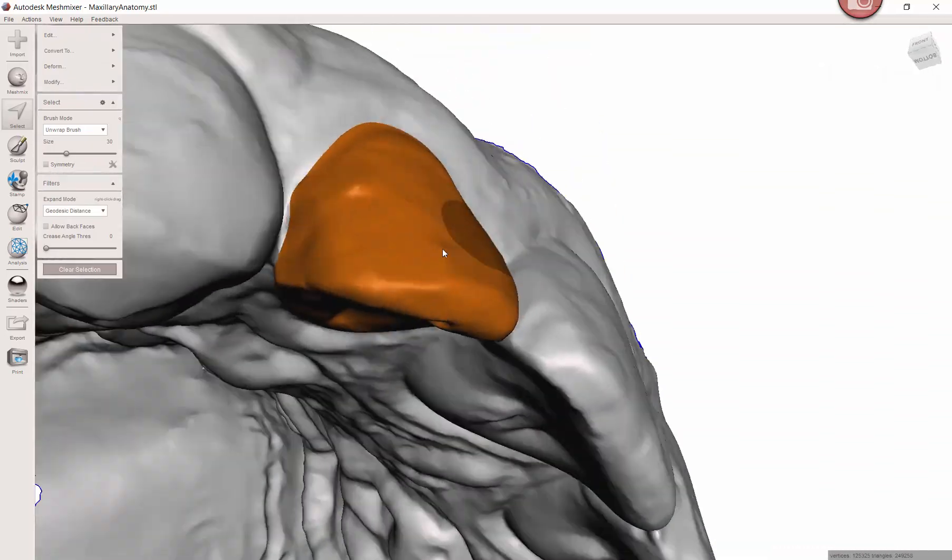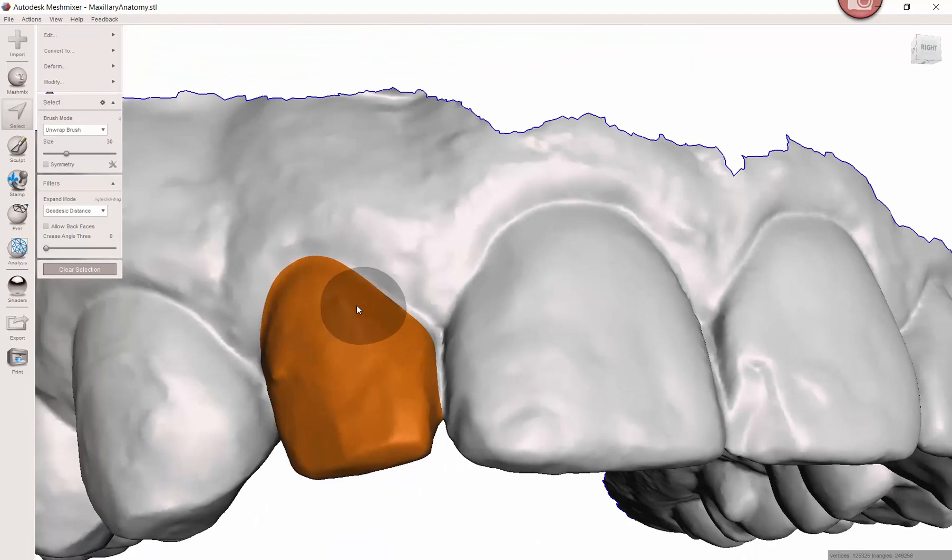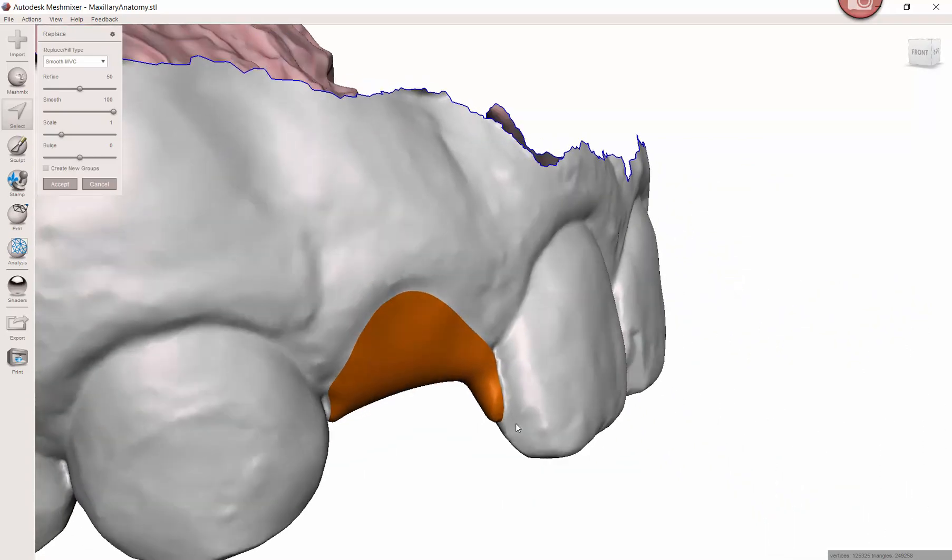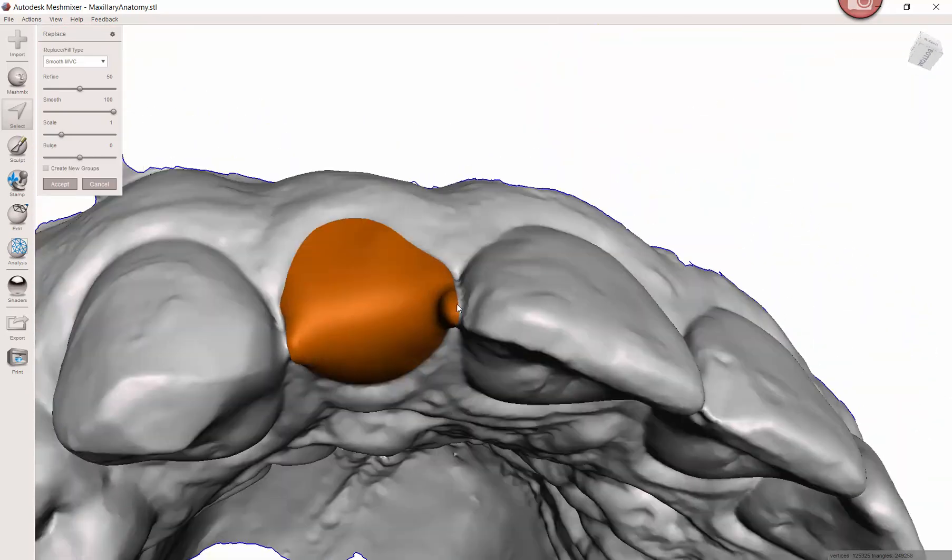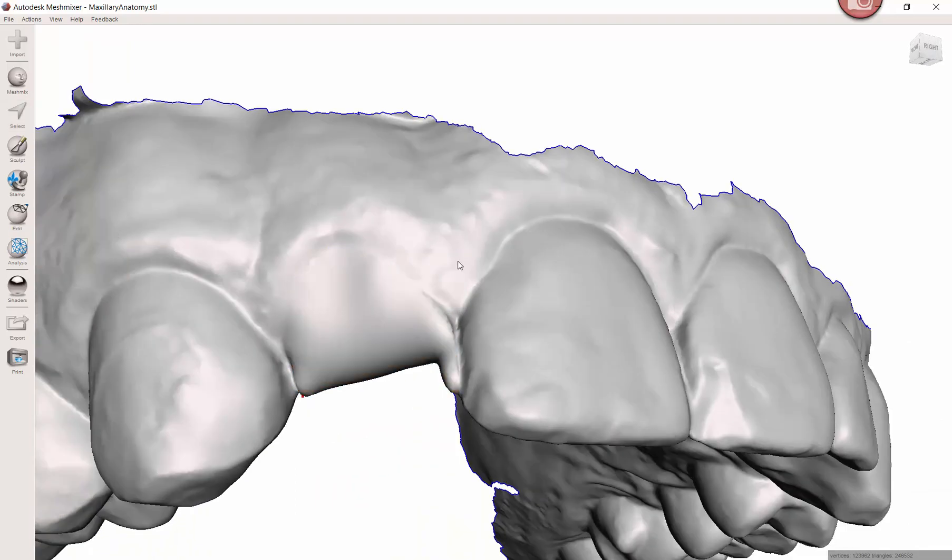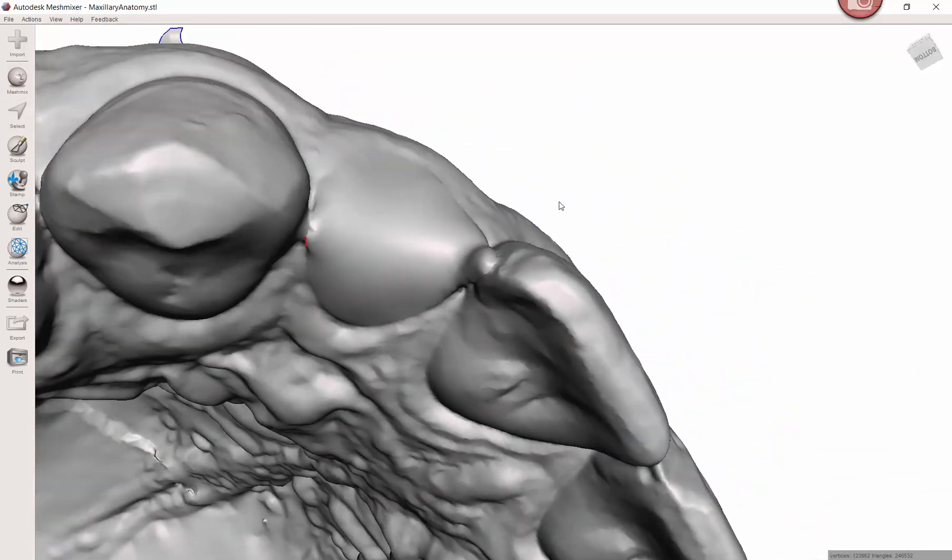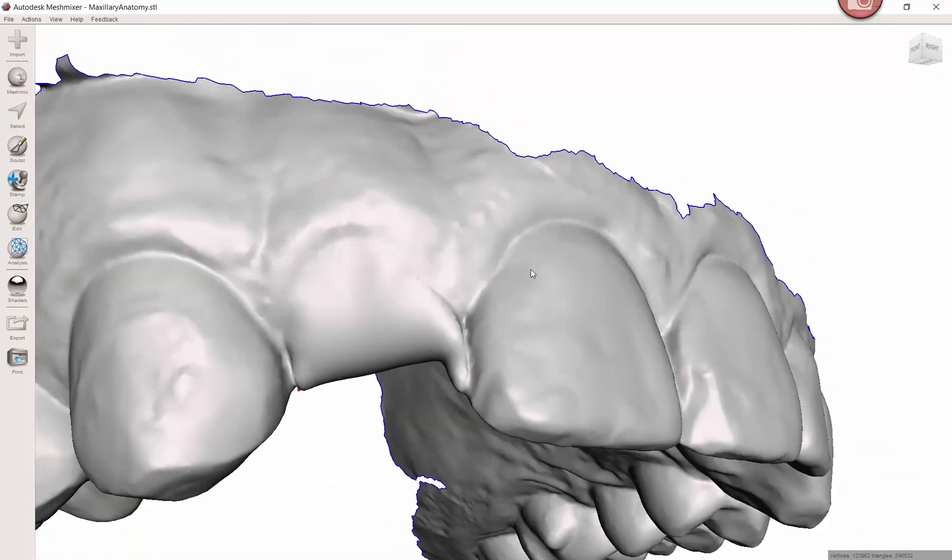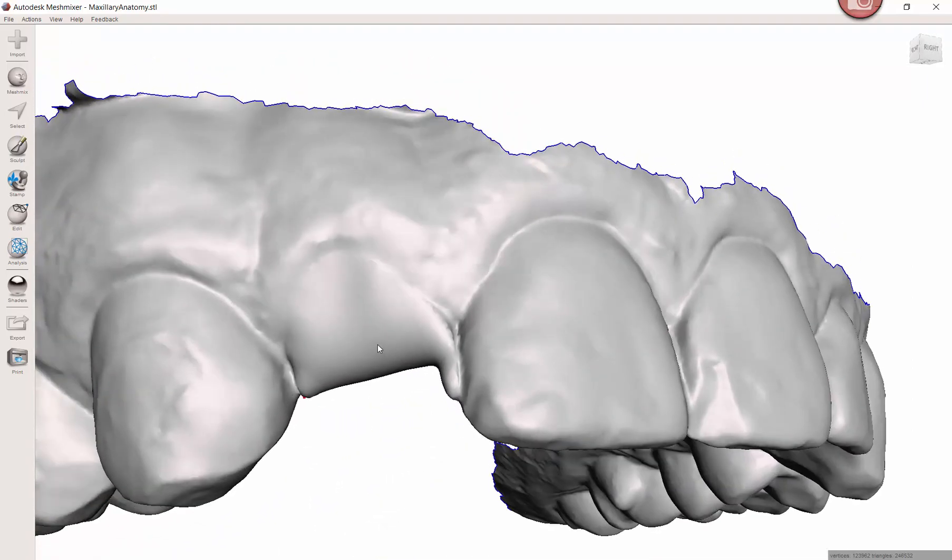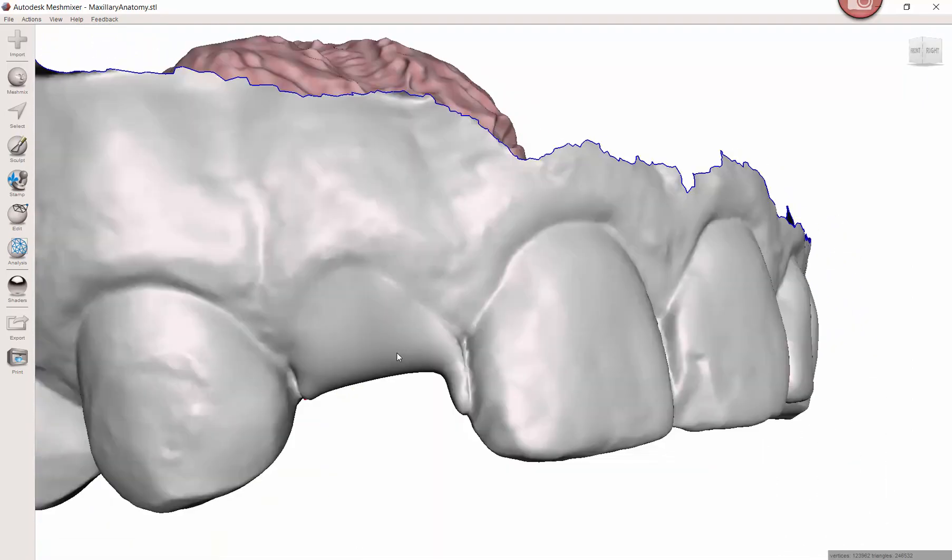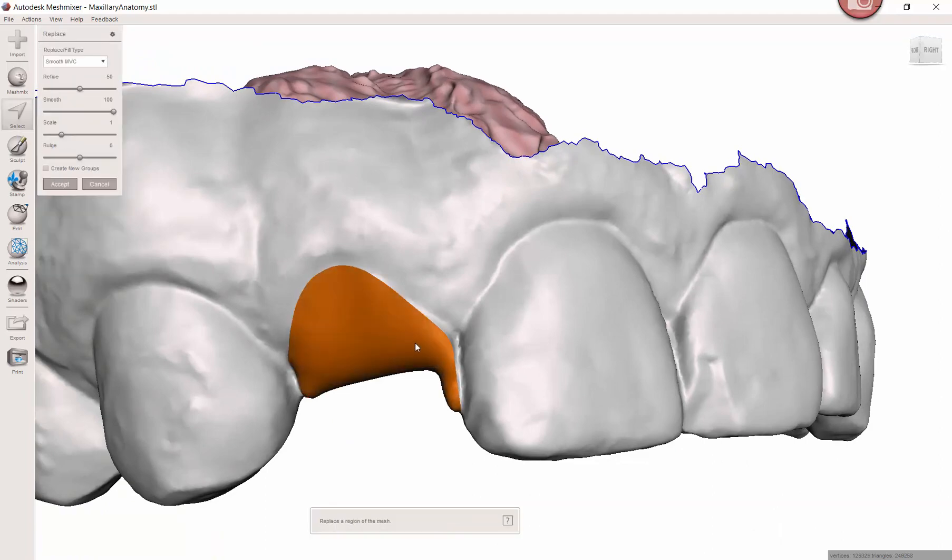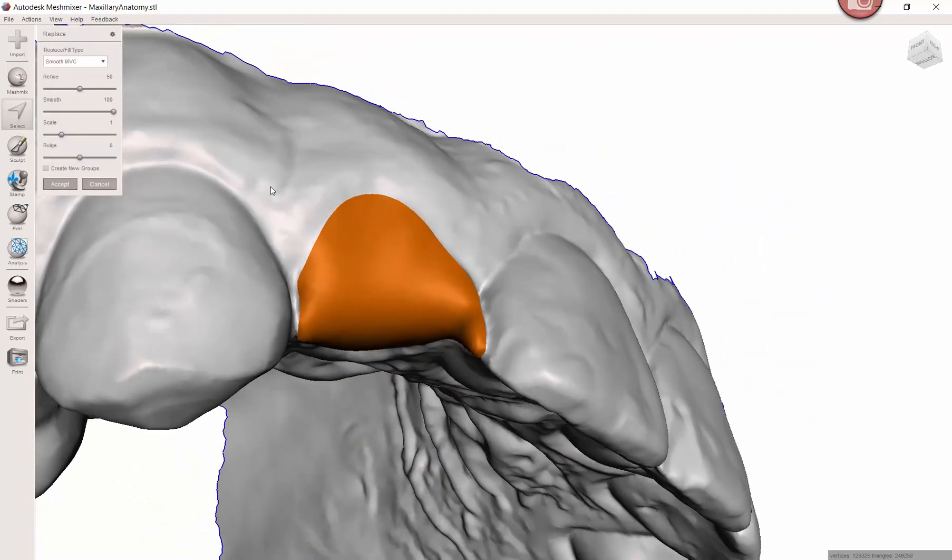The next big step is just to hit edit erase and fill, or the F button, and it's going to subtract out the teeth. You have the ability to just accept and be done with it. Most of the time I like to—we'll come back to this little red dot in a moment—but most of the time I like to actually create sort of an ovate pontic site. I'm going to hit control Z twice so I can get back into this.